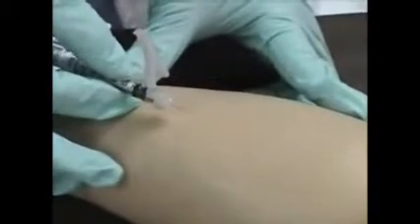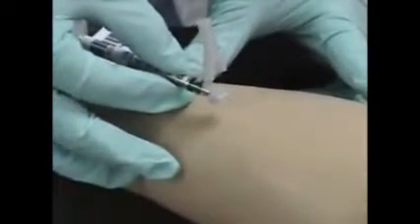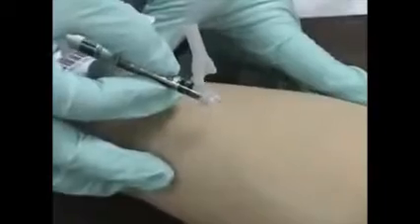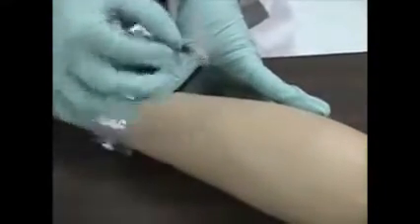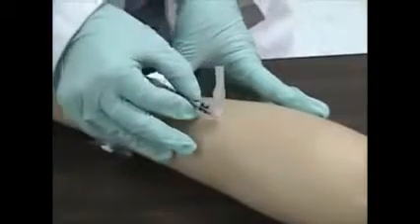When you insert the needle, insert approximately 1/8 of an inch so that the bevel is all the way under the skin. With my non-dominant hand, I'm going to secure my patient's arm. With my dominant hand, I'm going to hold the syringe on the top and inject.